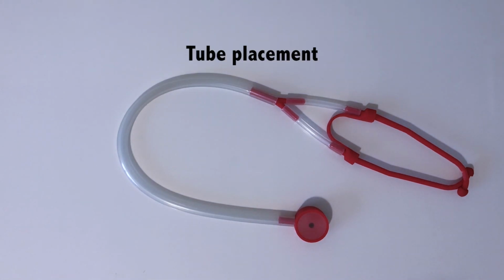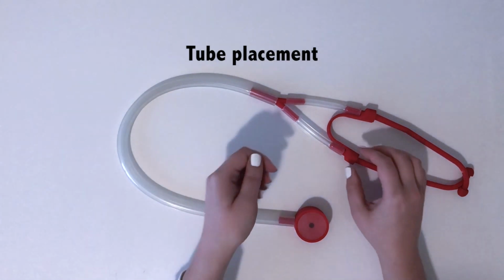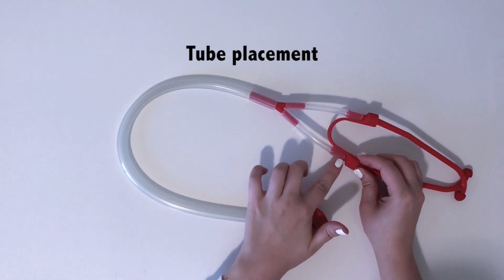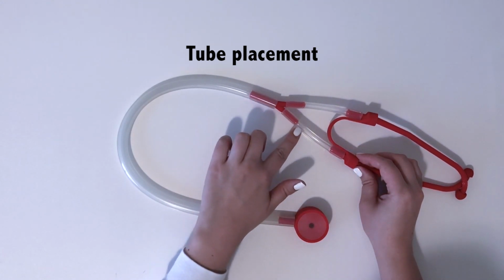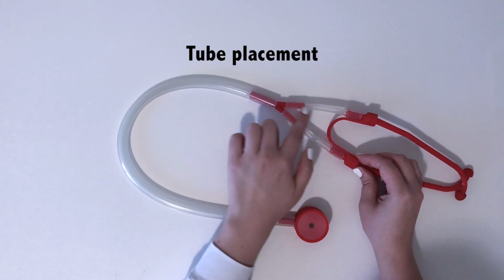Another common issue is with the tube placement. Make sure your tubes are at the appropriate height and equal on both sides. This is what your tube should look like on the earpieces and the Y piece.